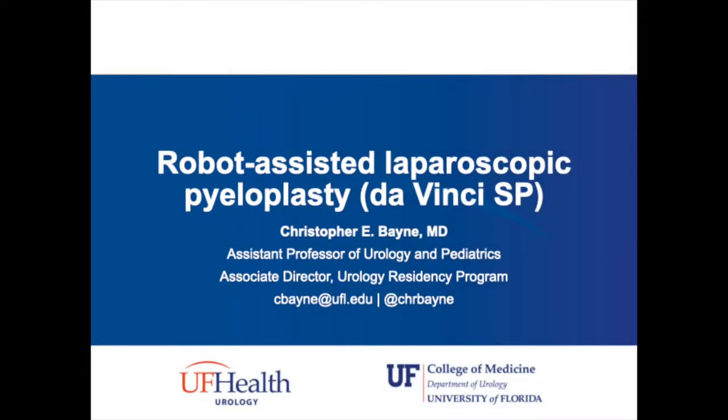I wanted to show a typical robotic procedure with the DaVinci SP system. This is a robot-assisted laparoscopic pyeloplasty.